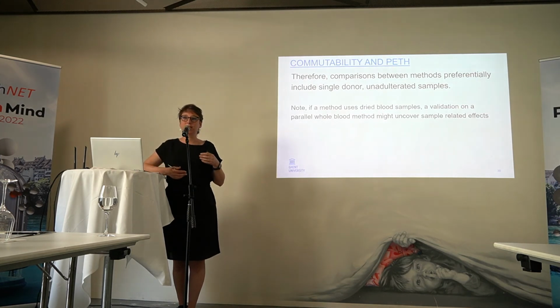And again, it's something that in the field of clinical chemistry, every now and then we have to readmit and reprogram ourselves and tell ourselves, just do it. It costs you money, it costs you time, but you need to. You cannot just rely on two artificially prepared QC samples to make a comparison. It doesn't work.